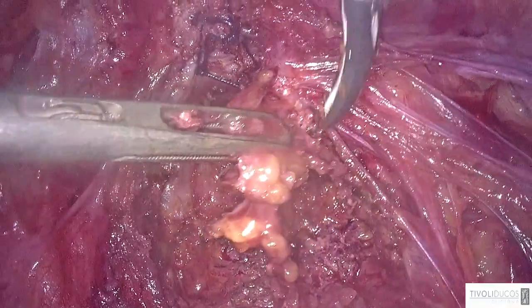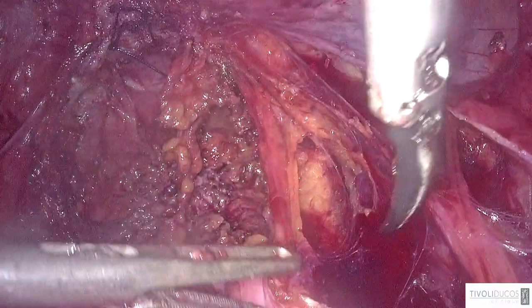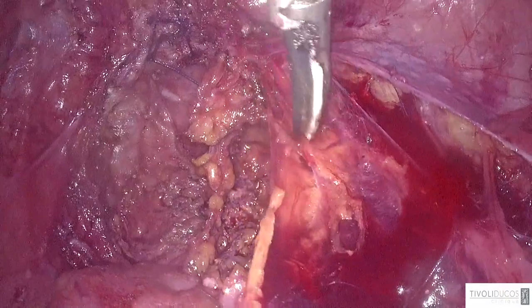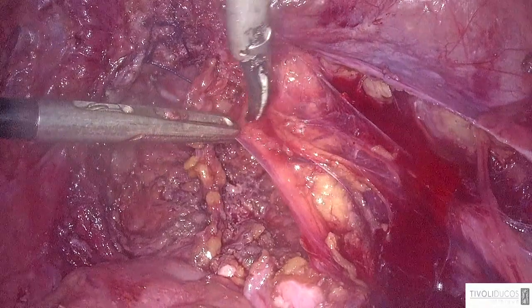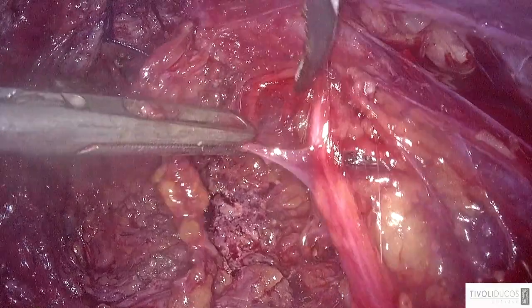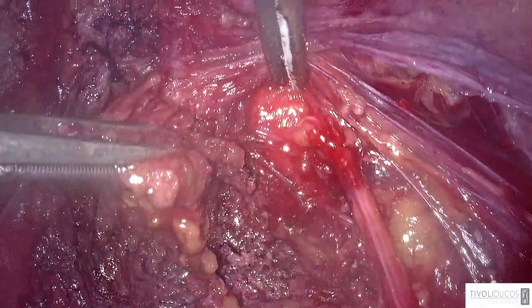So Horace, at this moment, could you show us the trace of the hypogastric nerve on the right? On the right, I would expect the hypogastric nerve to be somewhere here and not here. Here we are very close to the, or maybe here, maybe there. It may be this one. I think it is this one. It's going directly to the nodule, right? Yeah. That's why if it goes into the nodule, it's better to sacrifice.